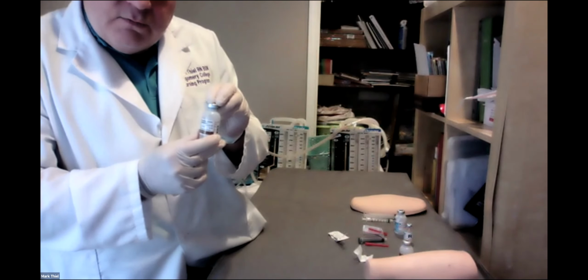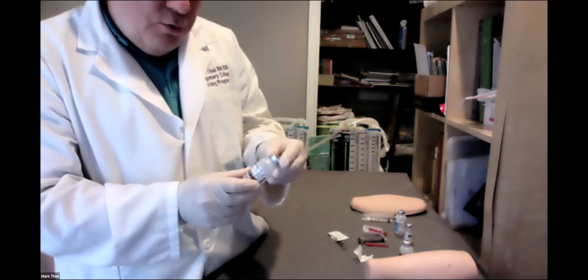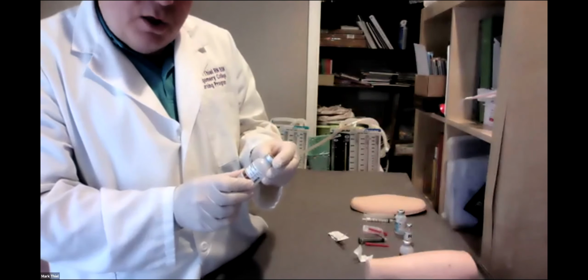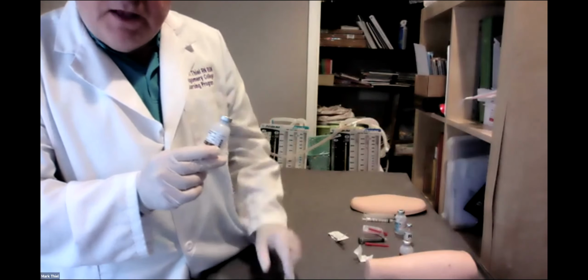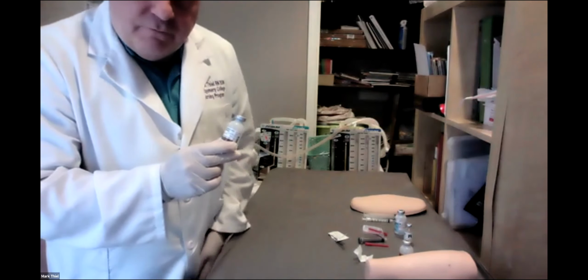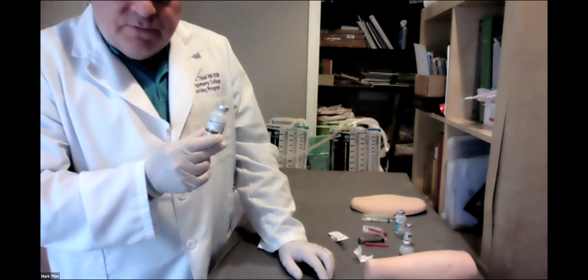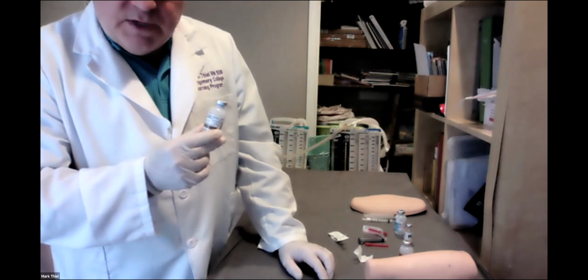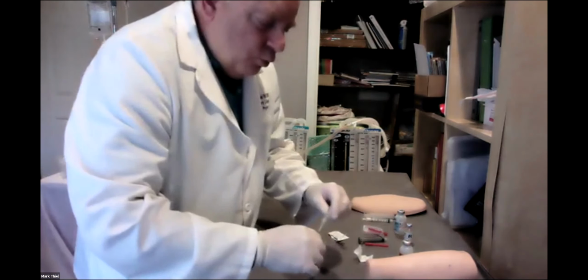Right. Now, dosing: 0.1 ml per intradermal injection. That is the standard for PPD injection intradermally, 0.1. So, what syringe would I pick?